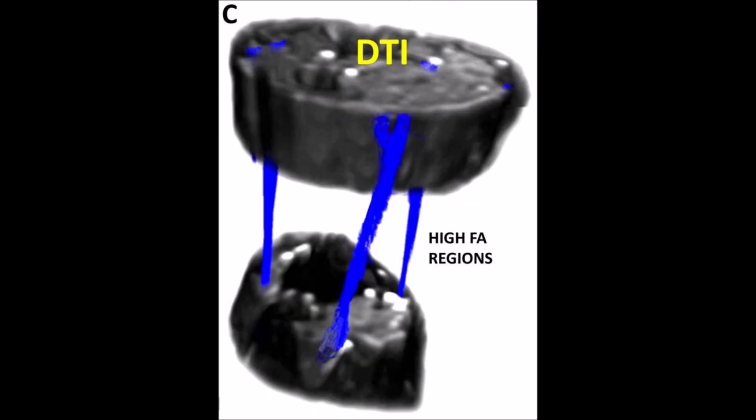Here is an image of DTI that is used to image nerves. As you can see, the spatial resolution of DTI is much smaller than that of an MRN. However, the nerves can be quantified as seen in the image. The nerves have a high FA region. That means that they are likely healthy and project water in a straight line.